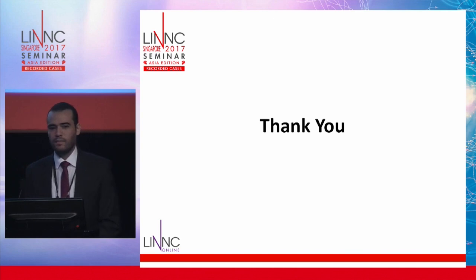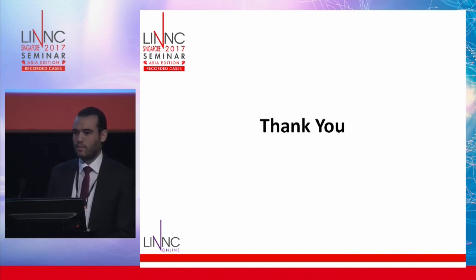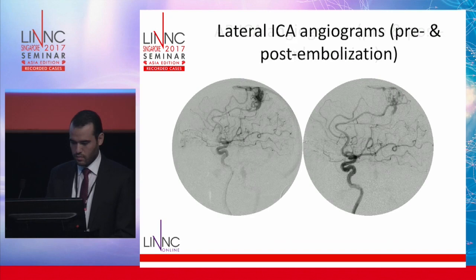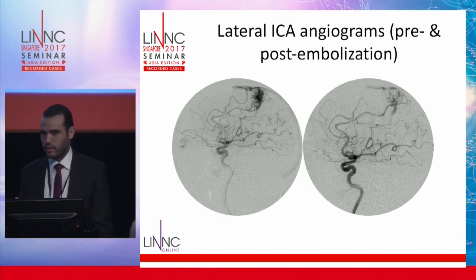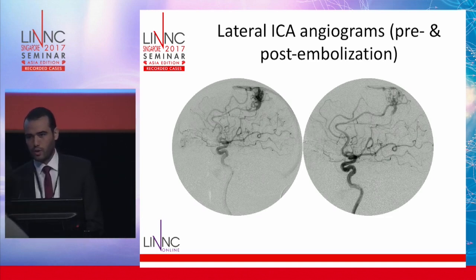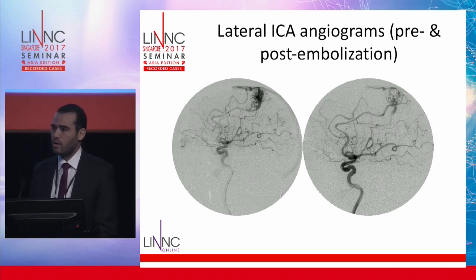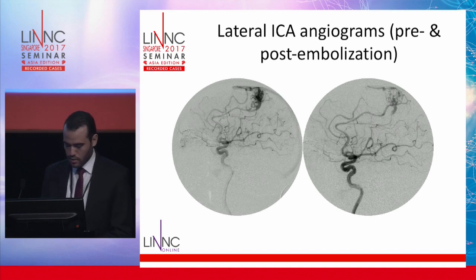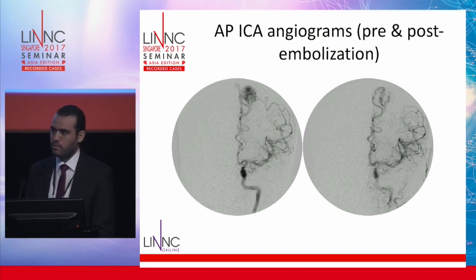Question there. It looked like venous thrombosis. Well, but we don't have any angiogram, so we don't know. Maybe we could see correctly the post-operative angio, but there is no post-operative angio. But the vein is patent in the post-embolization angiogram. The draining vein was patent. Well, it's patent, but it might occlude after, with slowing of the flow. Yes, that is important. This is the only picture you have? This is the only lateral, and this is the only AB. There is some onyx in the vein.